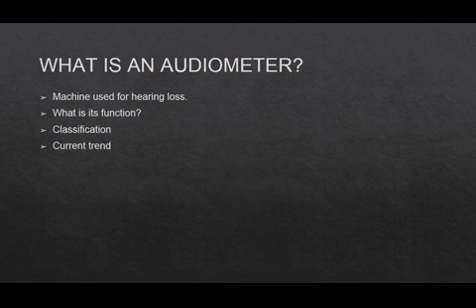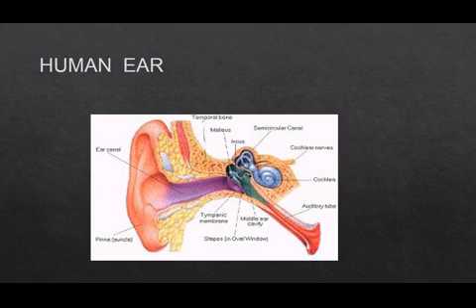They usually consist of an embedded hardware unit connected to a pair of headphones and a test subject feedback button, sometimes controlled by a standard PC. Such systems can also be used with bone vibrators to test conductive hearing mechanisms. Audiometer requirements and the test procedures are specified in IEC 60645 and ISO 8253, which are the standards. An alternative to hardware audiometers are software audiometers, which are available in many different configurations.